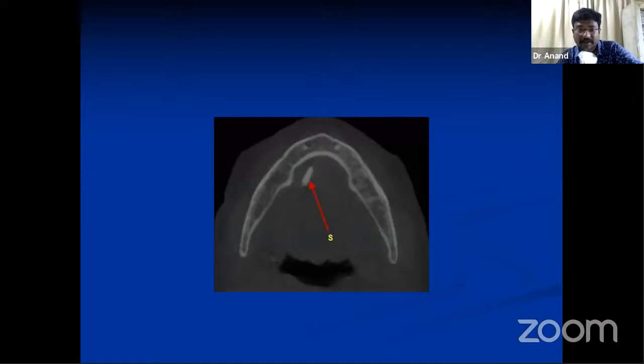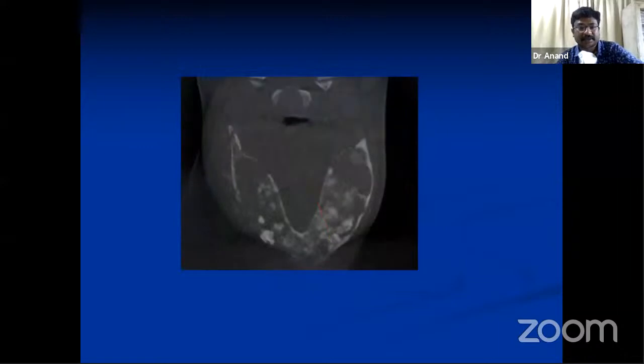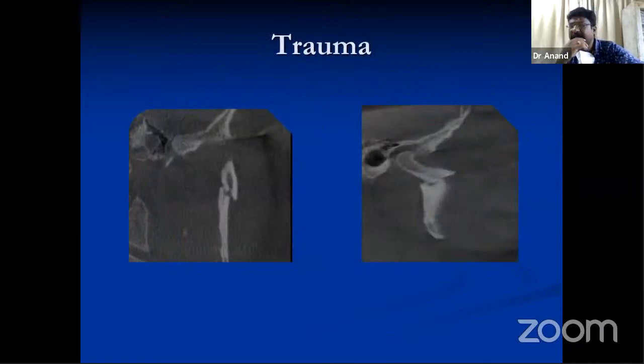Then a simple case of a sialolith, where we have conventionally used an occlusal radiograph to find this, can also be well visualized with CBCT. But you should know that only if it has been completely calcified will you be able to visualize it in a radiological imaging method. And this is one more case, a case of cherubism, where you can see the bilateral expansion and the teeth floating in air appearance. It is especially used in case of trauma, basically in relation to any kind of fractures of the maxillofacial regions, because CBCT has the capability to tilt or cut in any imaginable plane. So I can cut it and see along the axis. Usually, fractures in two-dimensional imaging sometimes cannot be visualized because the X-rays path along the line of fracture. But here, it can easily visualize the fractures.